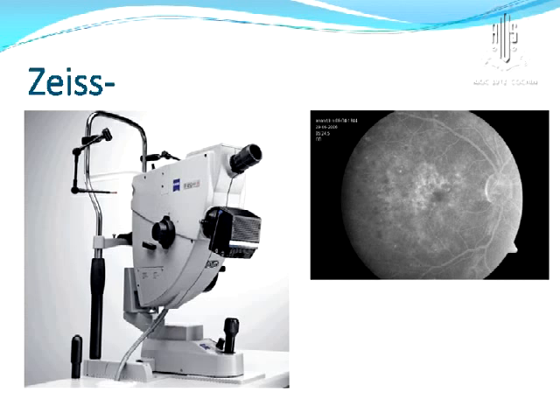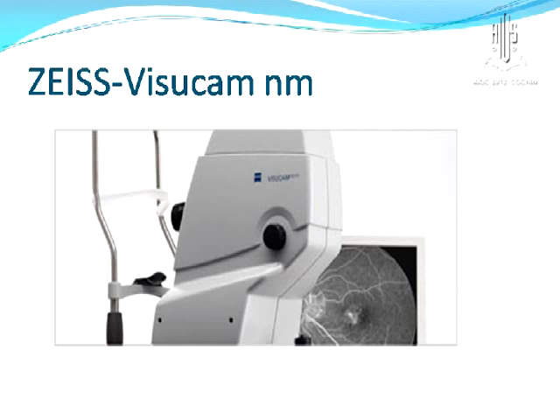The Zeiss camera is good in providing you very good photography. However, you should be careful that the original camera back is excellent. If you want to lower the cost and you buy the alternate camera back, then the images are not so good. This is something that you have to be aware of. If you want good images, you have to go for the original equipment. However, Zeiss has now come out with a newer model which enables you to get good images and it's economical.